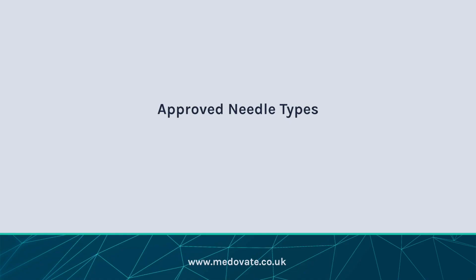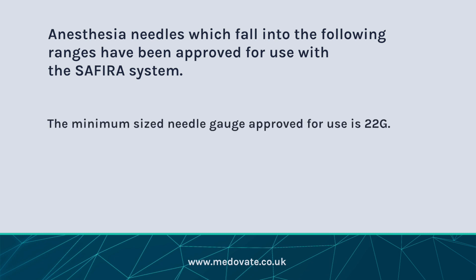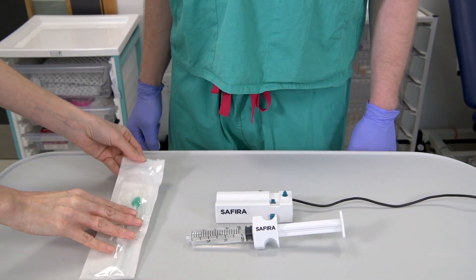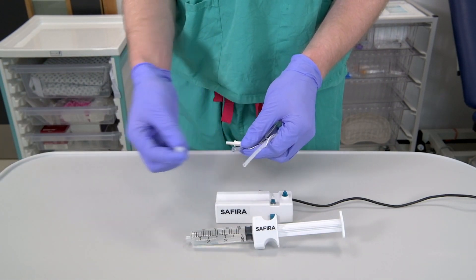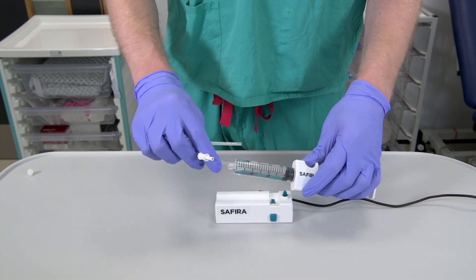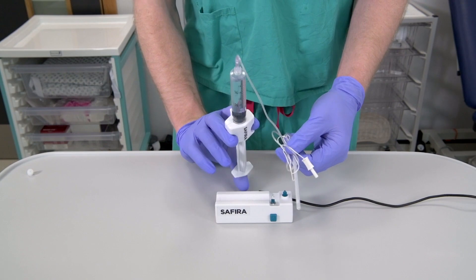Approved needle types. Anaesthesia needles which fall into the following ranges have been approved for use with the Sephira system. The minimum sized needle gauge approved for use is 22 gauge. The maximum length of needle approved for use with this system is 120mm. Aseptic technique should be used at all times during syringe filling and connecting the needle. Remove the selected needle from the sterile packaging and remove any safety caps. Connect the needle securely to the end of the Sephira syringe.